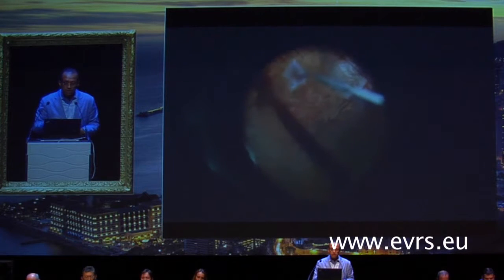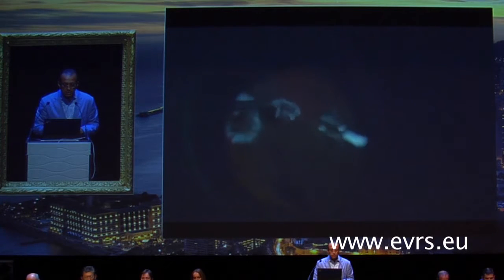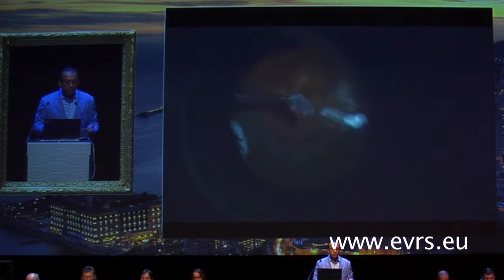I put laser, looked at the size of the hole, went in, and got an area a little bit larger than the size of the macular hole, did laser around it initially, and then gradually dissected it manually. So I have a chandelier, and I have forceps and vertical scissors. You can use the pneumatic scissors attached to the machine, or you can use manual scissors. And then I dissected off the bed, had the infusion up initially so we don't get any bleeding, and a few spots of diathermy at the areas of the blood vessels, and bimanually moved it to the fovea.